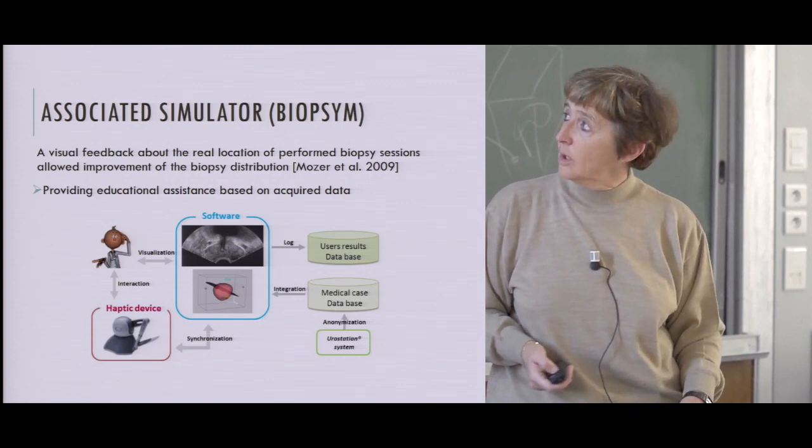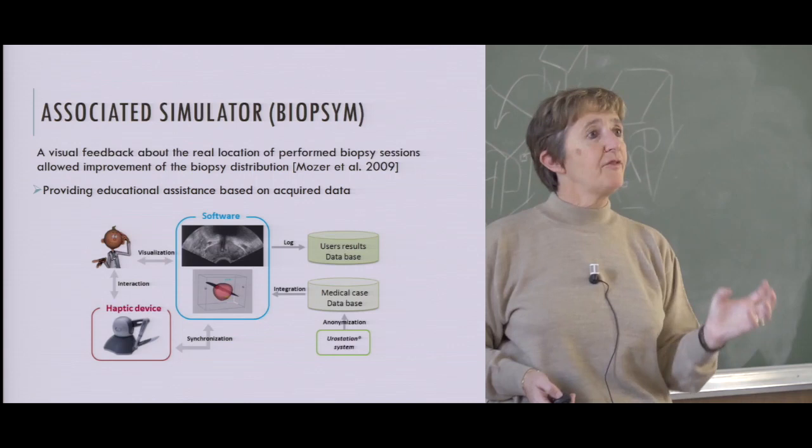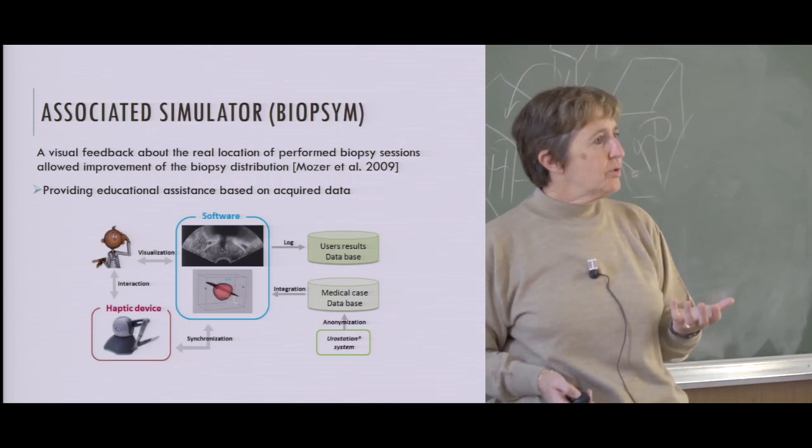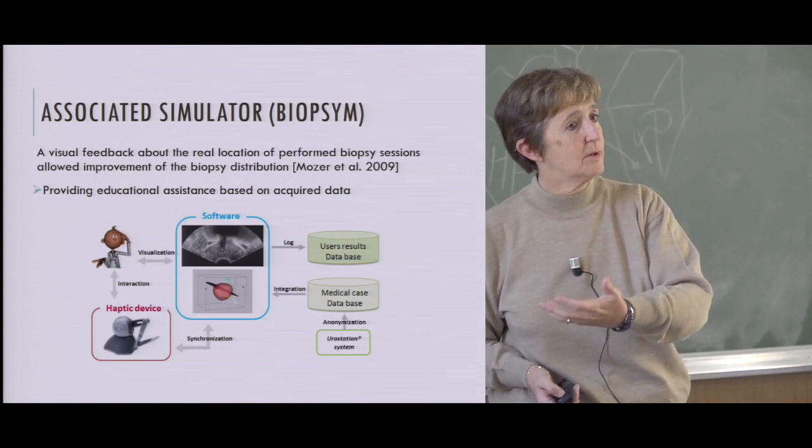And what was also interesting is that with one of the operators, we had a collection of testing like that, and even only the visualization after the gesture, without any assistance during the gesture, improved his ability to be accurate, because he had this visual feedback, and so he could improve from the first patient to the following patient.